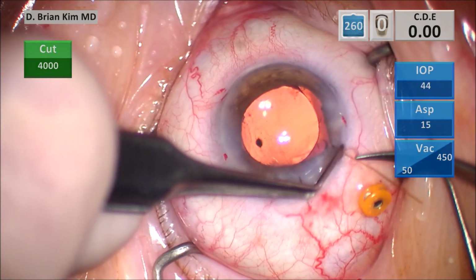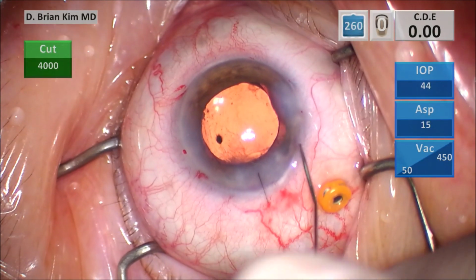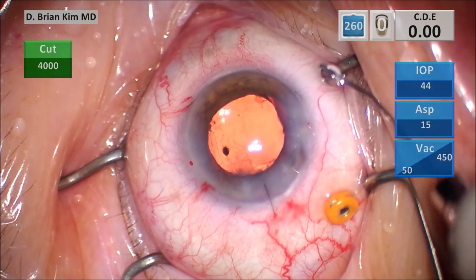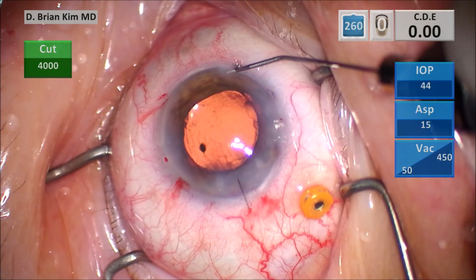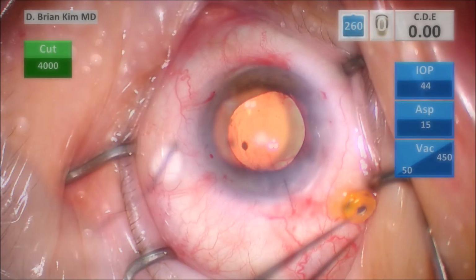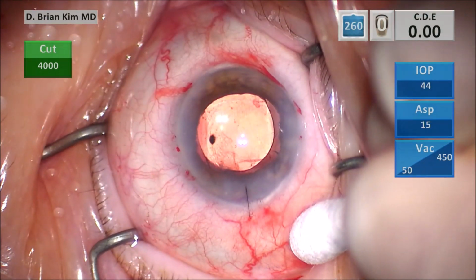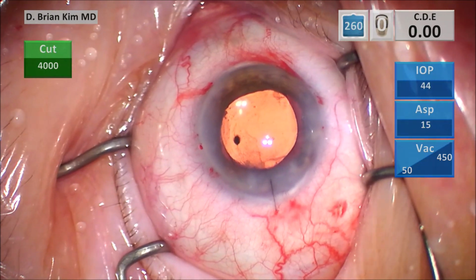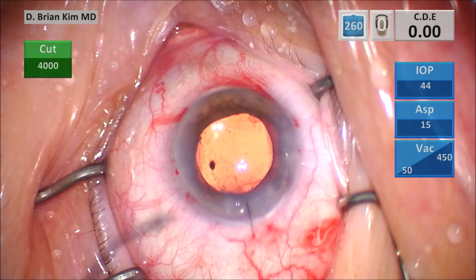There's really no zonular issue here. There was just a focal anterior capsule tear with an intact posterior capsule. It really makes no sense to remove that zonular and capsular bag complex. And I was able to open up the bag, deposit the lens in. Because it unfolds very slowly, I was able to tuck each haptic perpendicular to the tear. And despite that hole that was in the posterior capsule, this is what the patient looked like afterward.